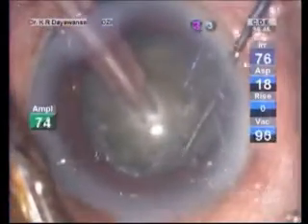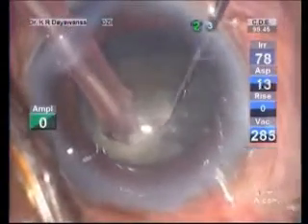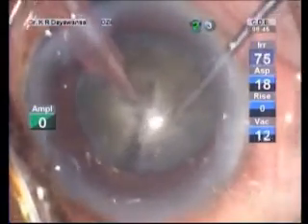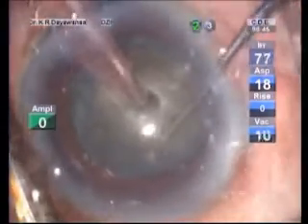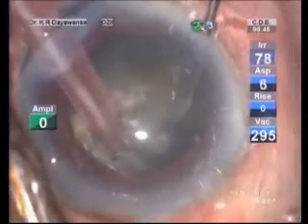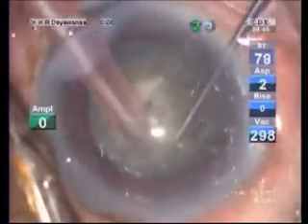Rotate the nucleus and engage the phaco probe at the edge of the hole and perform the vertical chop. Then rotate the nucleus and engage the phaco probe at the opposite edge of the vertical hole and make sure you get the two halves of the nucleus.